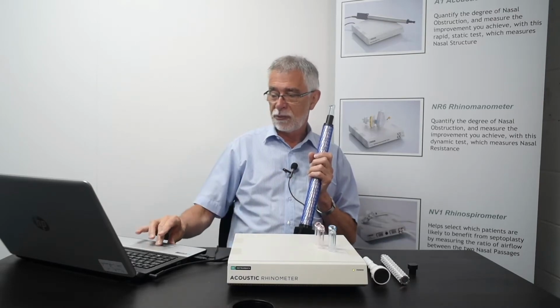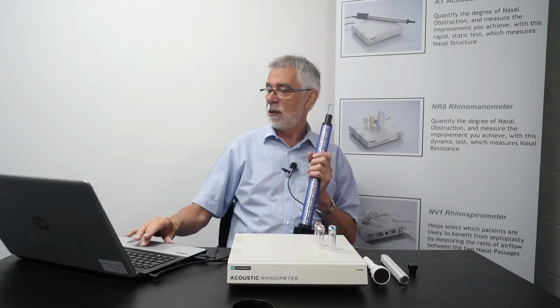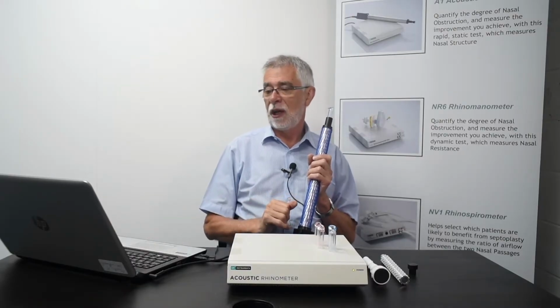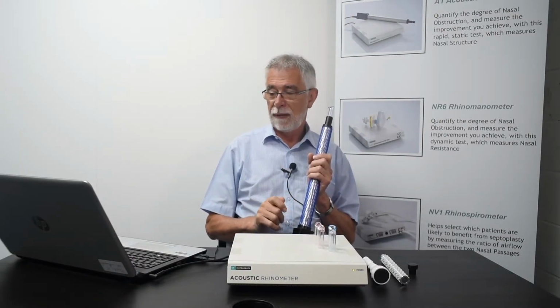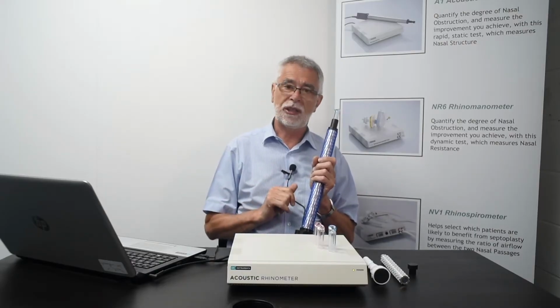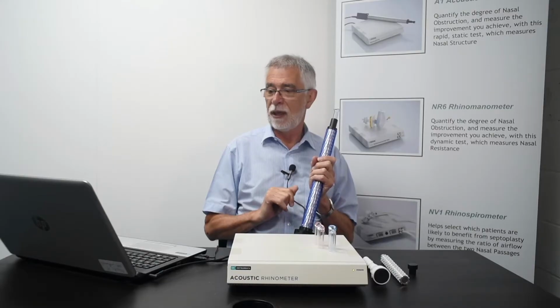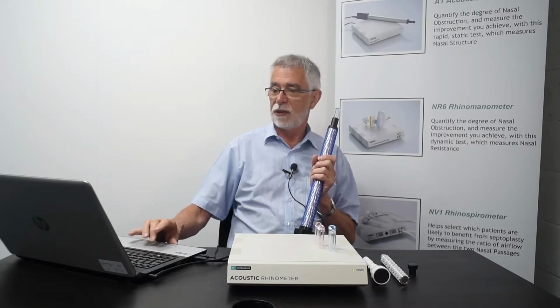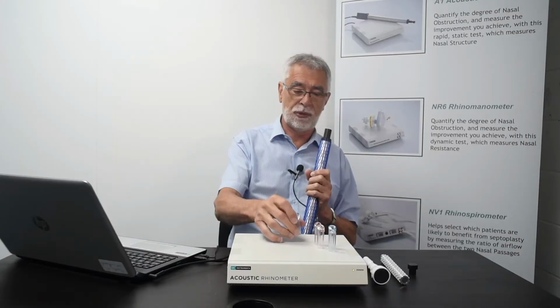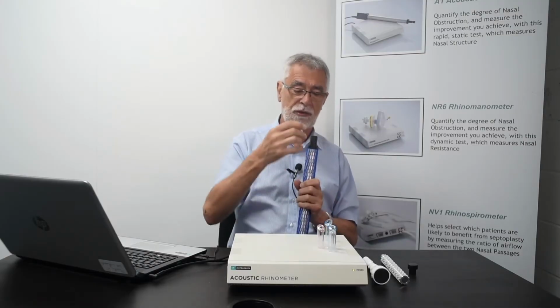The information at the bottom of the screen allows you to determine how severe the obstruction is for min 1 and min 2, and also to measure the volume between 0, the starting point of the nose, and 5 centimetres into the nose. That was a measurement for the left side. If we want to do the right side as well, then we would click the acquisition button, select the right nose, and if appropriate, change the nose piece over.